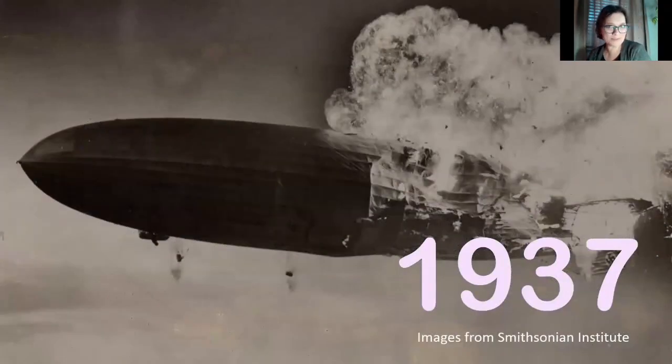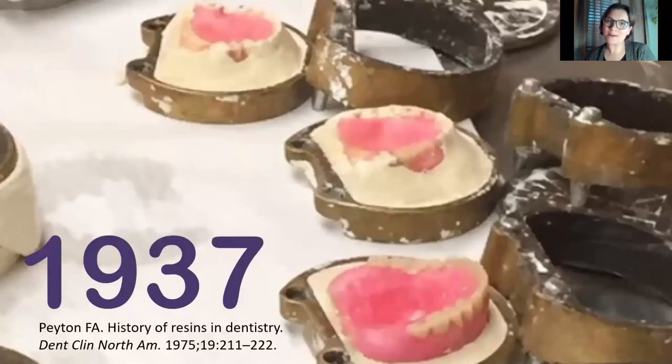So let's move forward from 1920 all the way to 1937. The year the Hindenburg exploded, Amelia Earhart took her flight across the ocean, and FDR was president. That was the same year we started processing complete dentures with polymethyl methacrylate. And these press pack dentures shown in these flasks could be from 1937, but they are from about the 2010s. And these are some cases that I was working on with one of my labs. And I just found it fascinating that the same protocol barely changed in nearly a century.